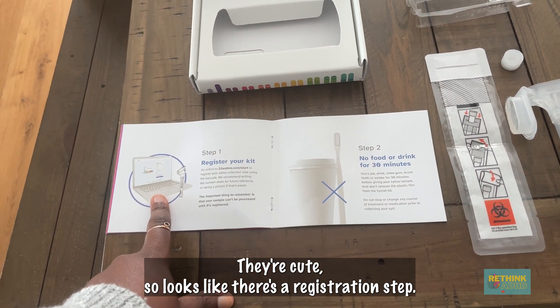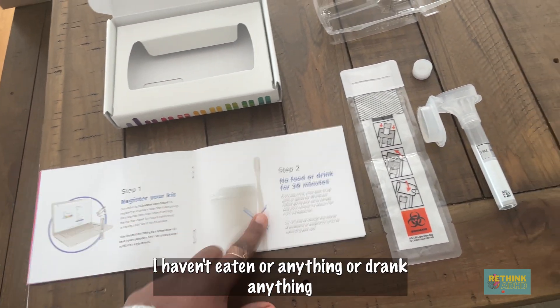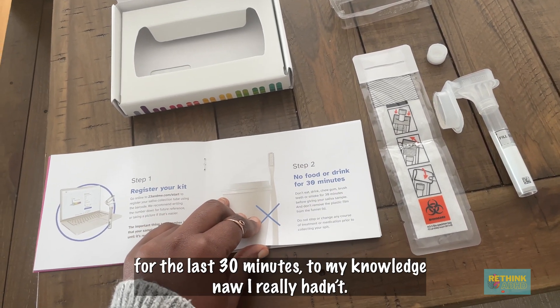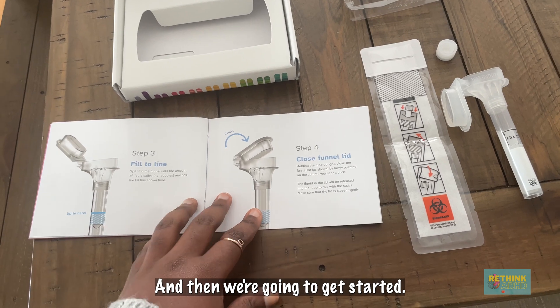It looks like there's a registration step, so I'm going to go ahead and do that. I haven't eaten or drank anything for the last 30 minutes. And then we're going to get started.